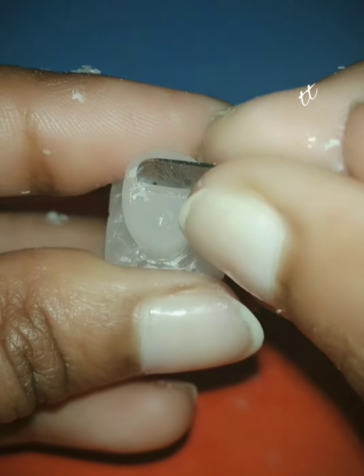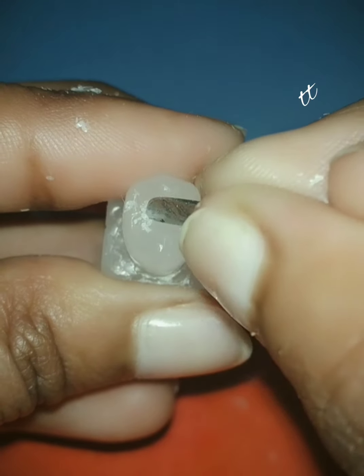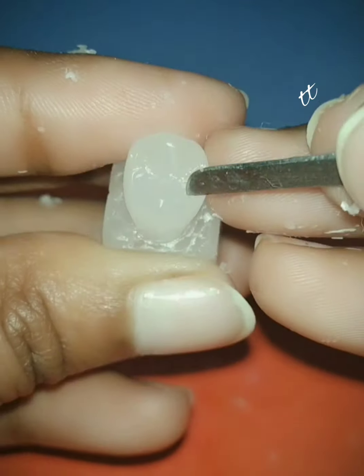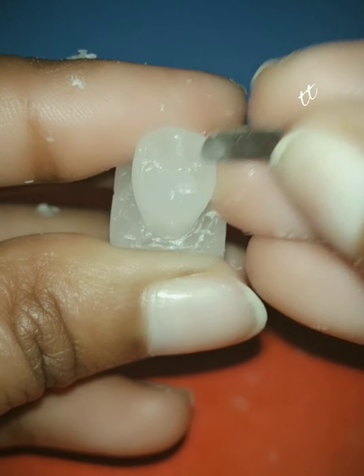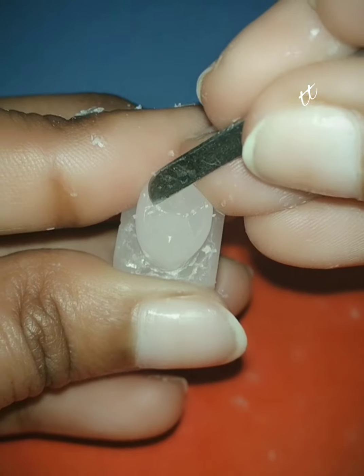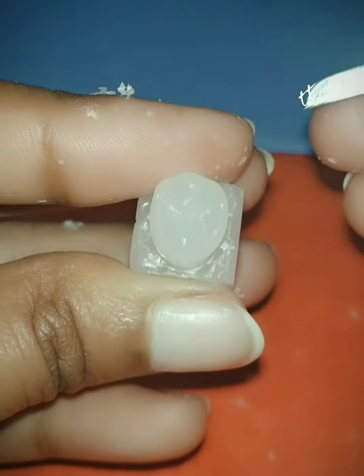Now we have to mark the central groove, mesial marginal developmental groove, and also the collateral developmental grooves that join the central groove just inside the mesial and distal marginal ridges. Also we'll carve the mesial and distal triangular fossa.